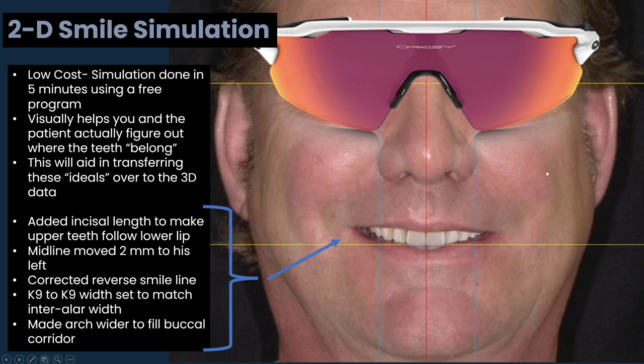You can see this is a very realistic-looking simulation. We can make multiple versions quickly and show this to the patient — or in a male's case, show it to their wife, girlfriend, or daughters. If you start doing these routinely on patients interested in comprehensive treatment, you'll be amazed at how much easier case acceptance is. I want them to want the treatment I can provide.